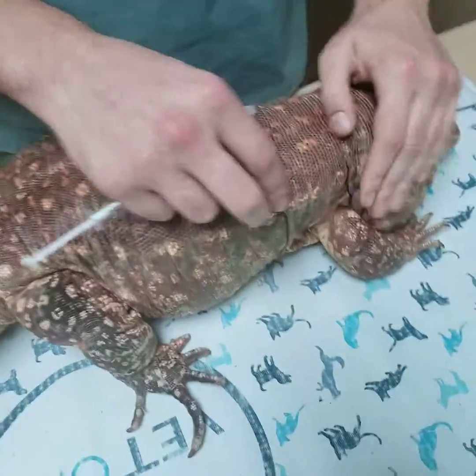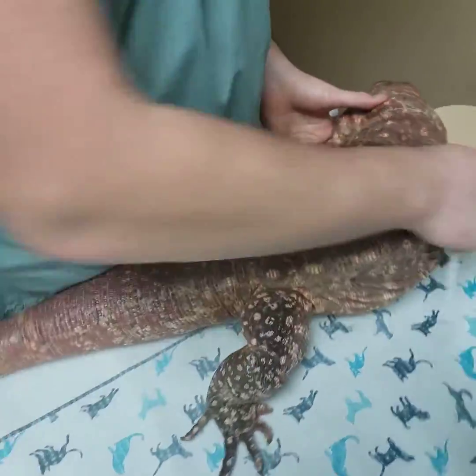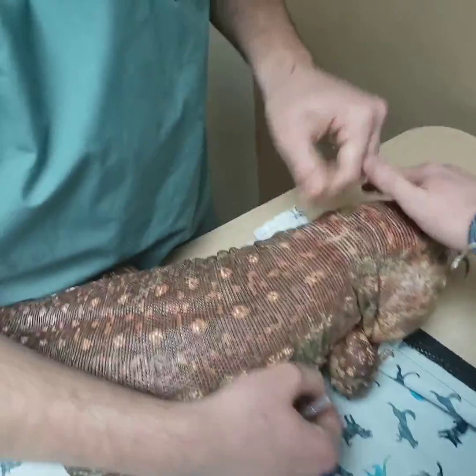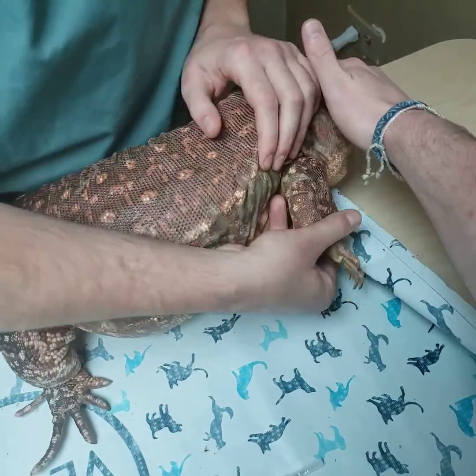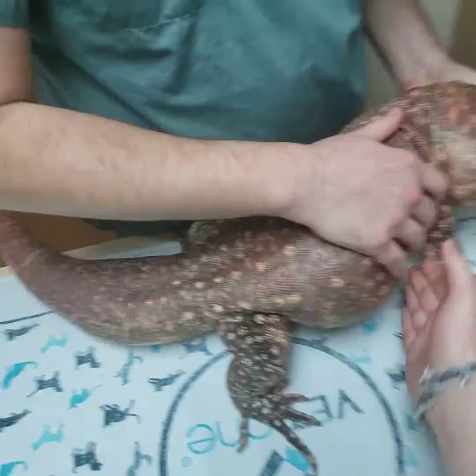The other hand can potentially be under the tail or under the belly. Areas that we're going to be shooting for are either right here over the shoulder where we can pinch up a little skin, or into the triceps muscle which is right in front of the elbow right here. I usually like to do over the back.